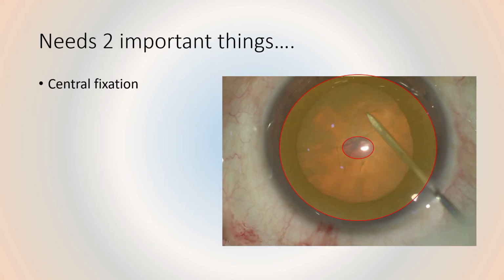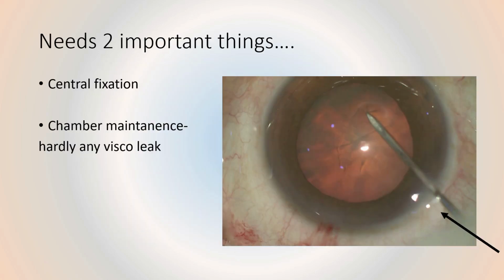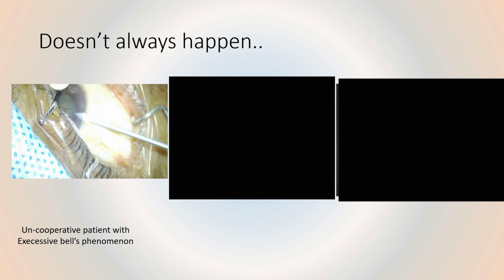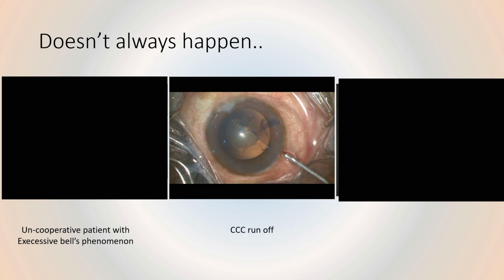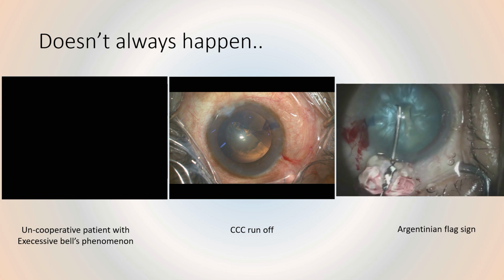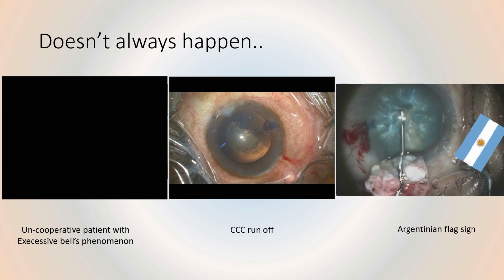It needs two very important things: central fixation, and chamber maintenance with hardly any viscoleak. It doesn't always happen. There can be an uncooperative patient with excessive Bell's phenomenon. The rhexis may run off, or the deadly Argentinian flag sign may be seen.